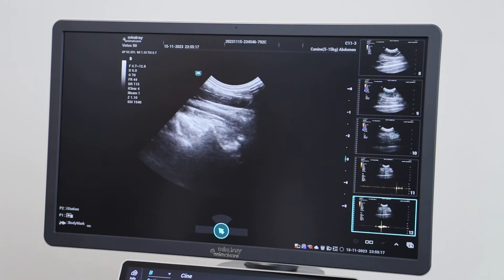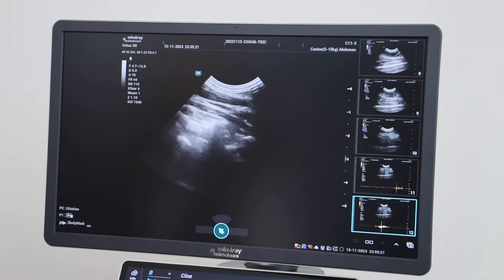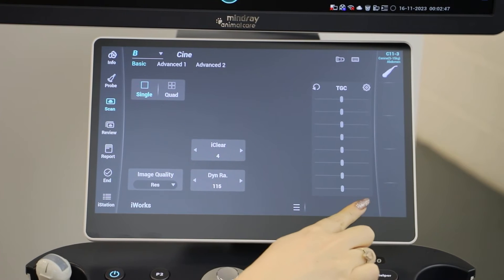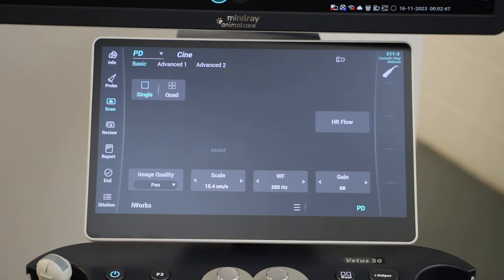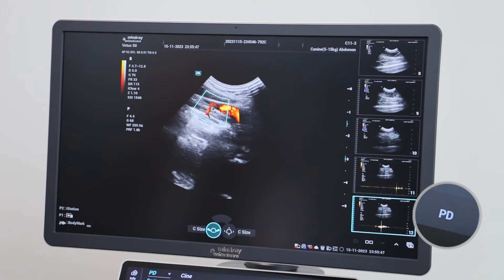Power Doppler is helpful at detecting low velocity blood flow in the abdomen, whereas color Doppler is used to detect direction of blood flow. To get to Power Doppler, look to your small screen and on the bottom right you will see PD — press this to access your Power Doppler.